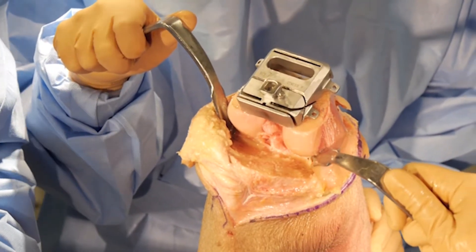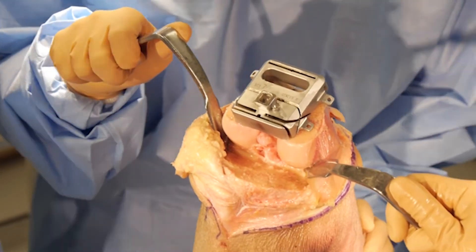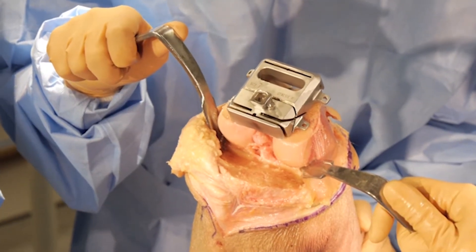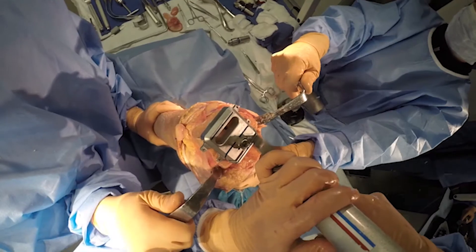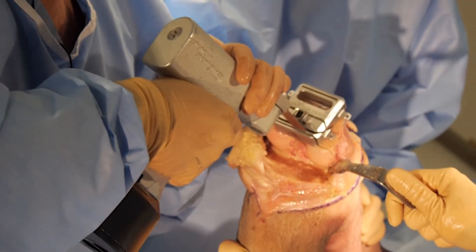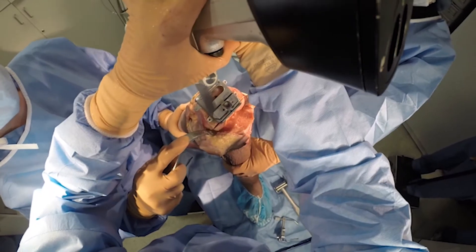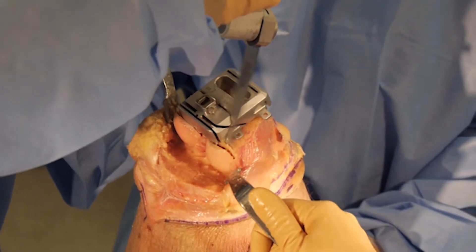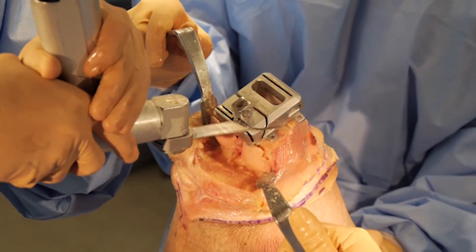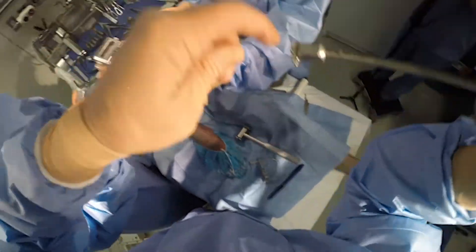Now I've got retractors in both medial and lateral positions. A crucial step before cutting on the medial side is to make sure you don't cut your MCL — your retractor must protect it. Similarly on the lateral side, make sure you're not cutting the patella or patellar tendon. Now I'll do my posterior cuts — once you see the bone on the posterior aspect of the femur move, you know you're all the way through. Then I'll do my posterior chamfer and anterior chamfer.